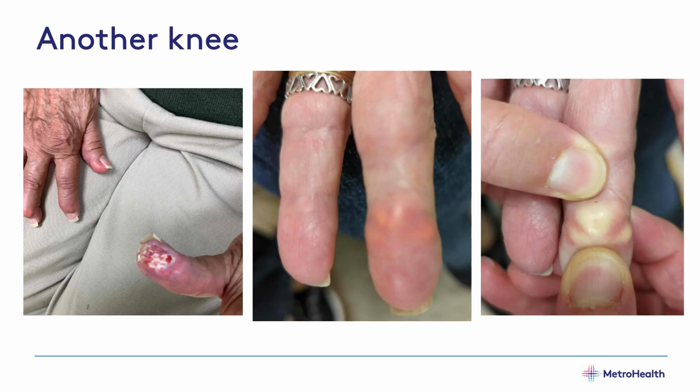Here's a patient in her 80s without a history of podagra, but with a previous history of ankle pain and a knee aspirate once that didn't show any crystals. She saw the PCP for an open wound of her finger, as you can see here, with white stuff.